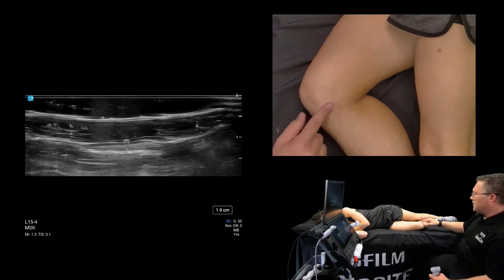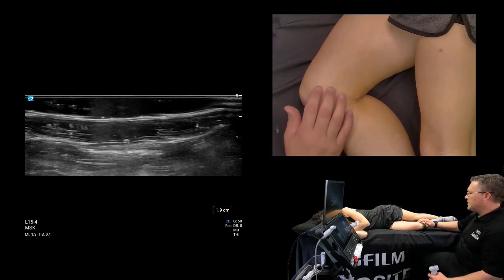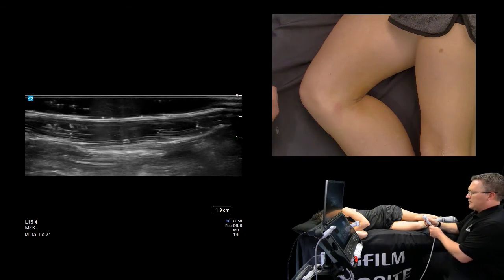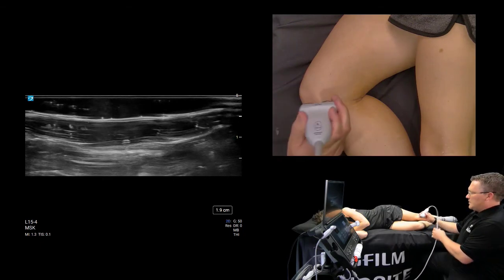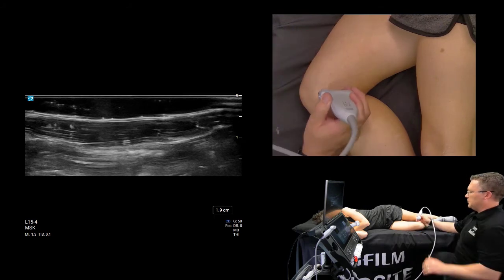this shape. I'm not going to see any pes complex up here at the joint. I'm not going to see it any further distal. It's just right around, right in that trough where I can feel the medial tibia. So palpating ahead of time, studying this anatomy is very important. Try to confirm it with ultrasound. I'm going to keep the left side of the screen anterior. I'm going to start cross-sectionally so I can show you what the medial epicondyle of the femur looks like.